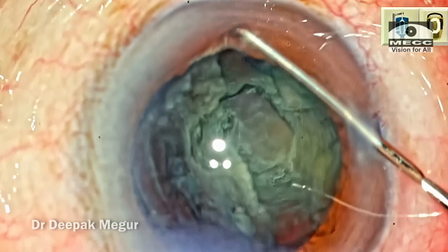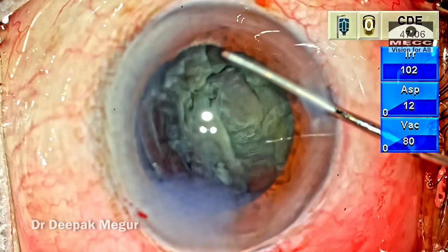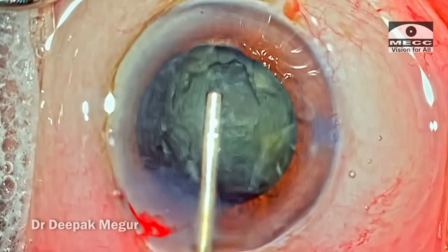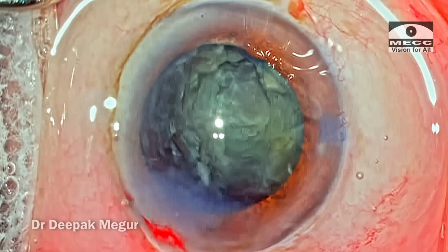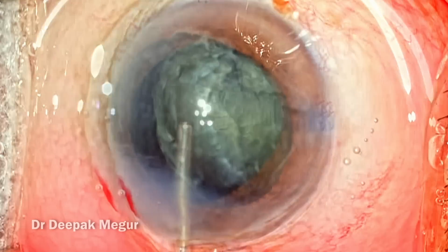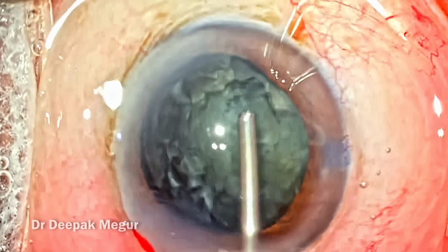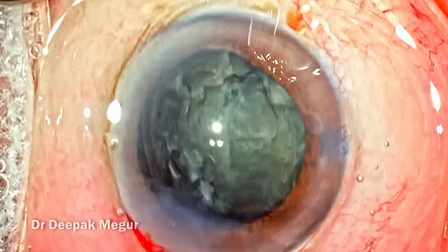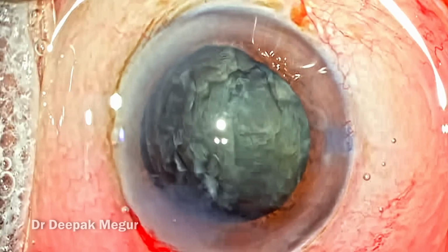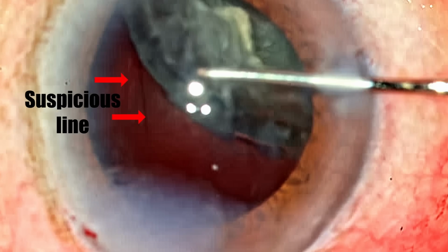So immediately when I come in, I notice that the rhexis is broken and I want to be very gentle with the maneuvers. At this stage, I still believe the PC was intact. The left side of the nucleus is tilting up. So these subtle signs are very much suggestive that something is wrong. So I'm definitely suspecting a posterior capsular tear at this stage, but as we all know, we can't see the tear because of the overlying nucleus. I just had a glimpse of few wrinkles that was suspicious.